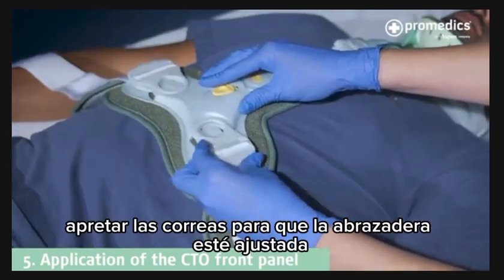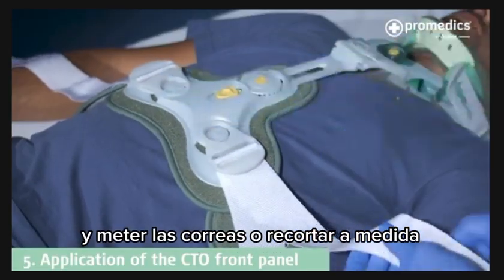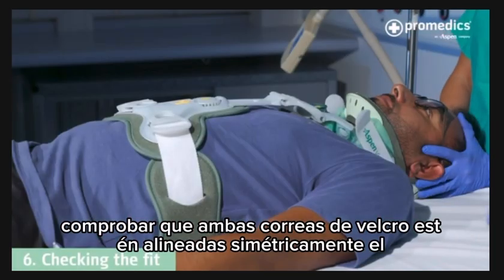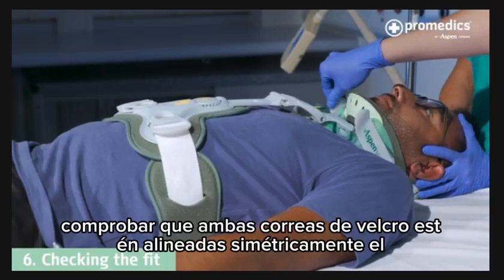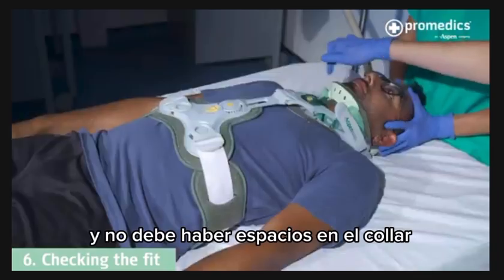Pull the straps tight so the brace is snug and tuck the straps in or trim to size. Check both Velcro straps are aligned symmetrically. The collar should be flush with the skin and there should be no gaps in the collar.